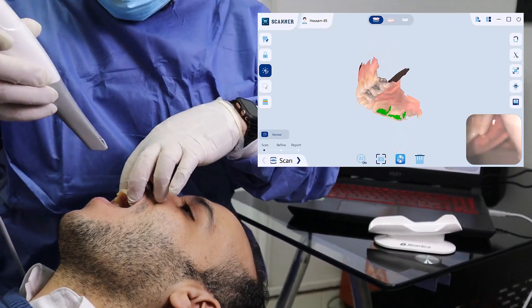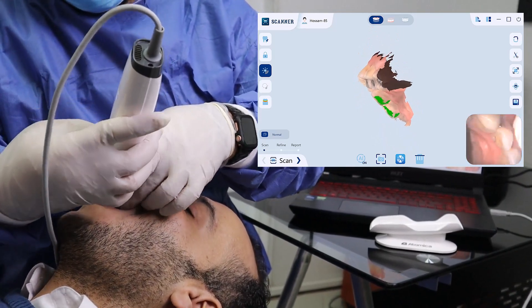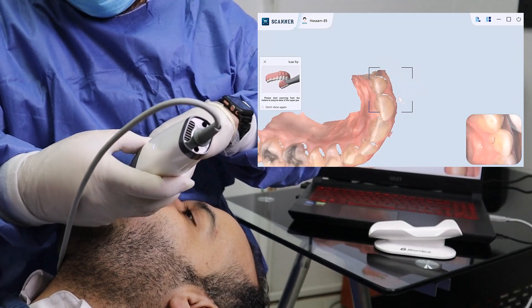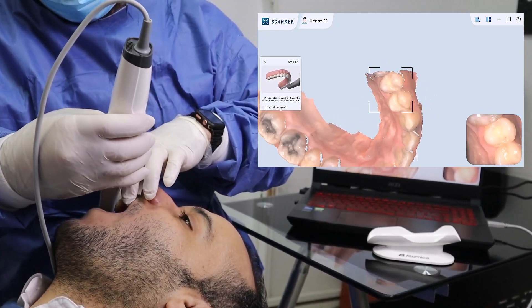Same for the anterior teeth. Start incisal and move labial and palatal. Tilt the scanner to move to the other side and use the same technique.